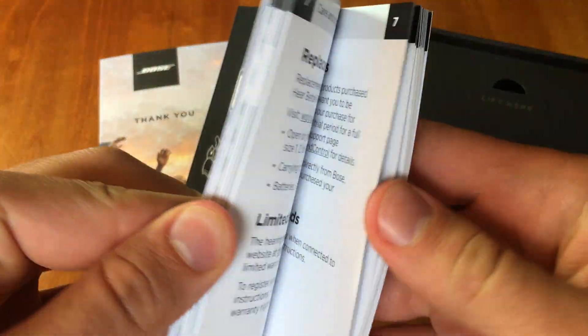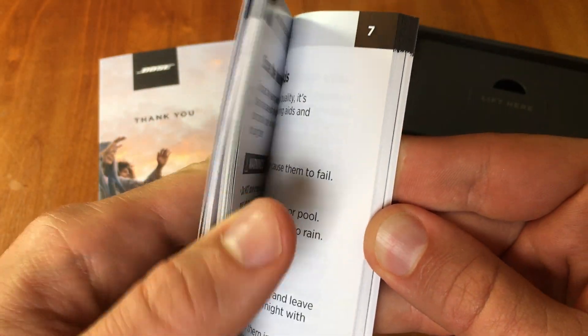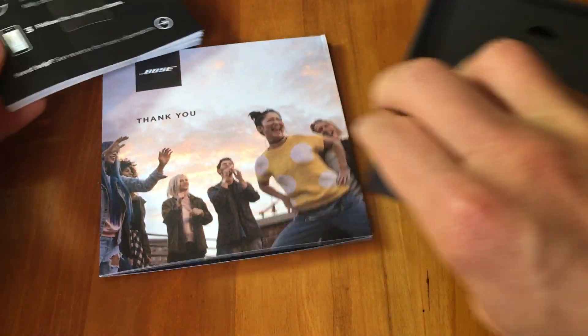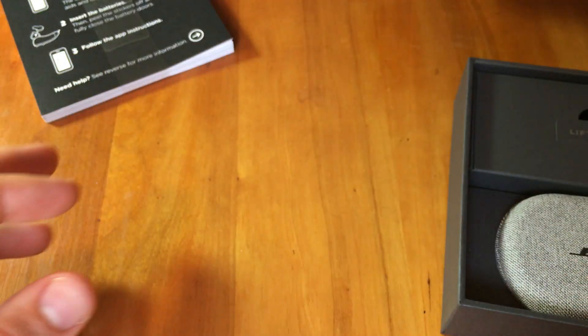Going through this deck you can see all of the instructions about how to use them, how to put them in your ears, how to connect to the smartphone app and all that. There's great instruction material inside this card, giving a little welcome and showing you different product support materials.